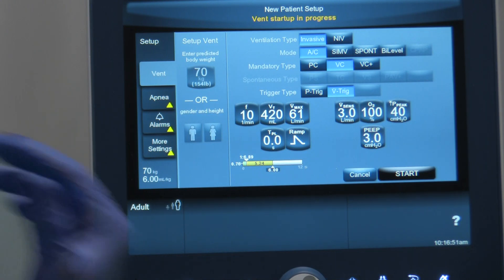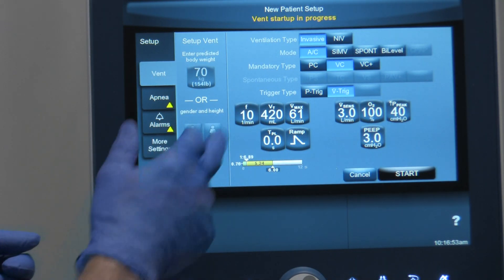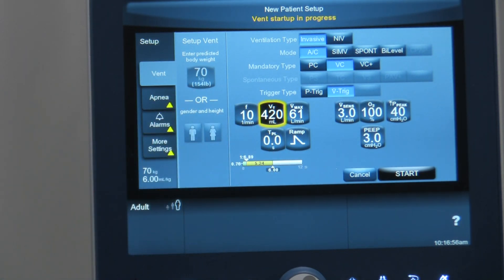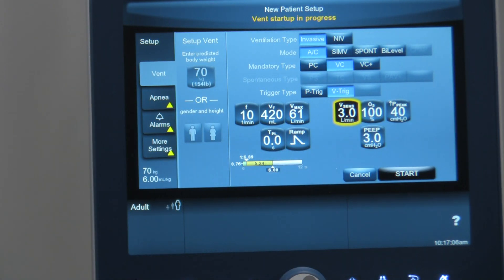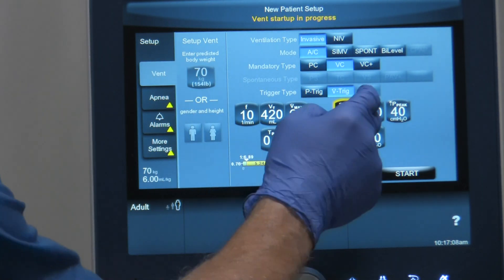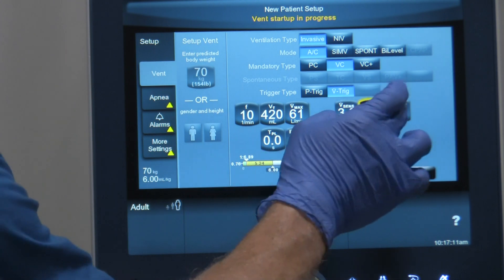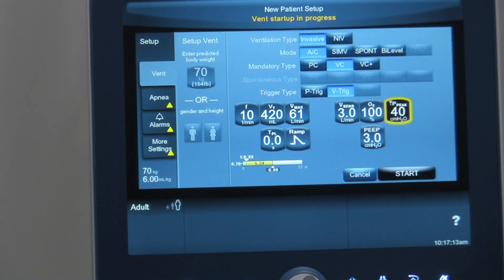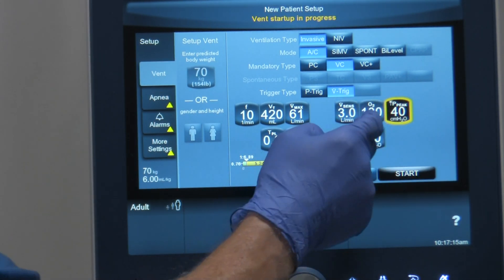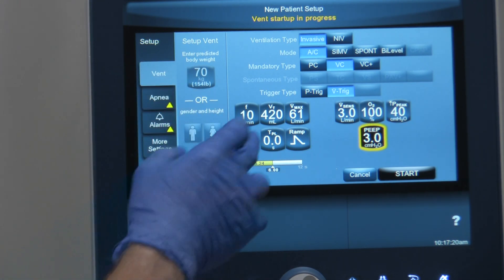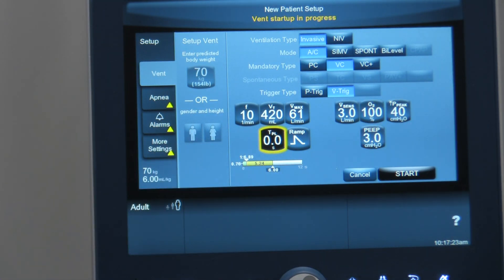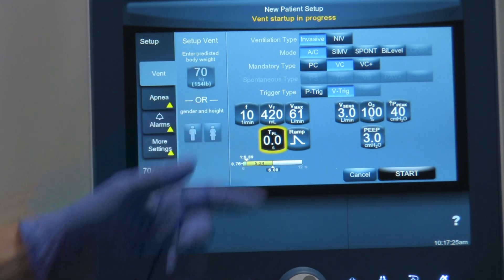The settings we can choose from include respiratory rate, tidal volume (since we're volume-ventilating), flow rate, and in setting the tidal volume and flow rate you get a TI time. It also lets you choose the sensitivity you want, the FiO2 delivery, your high pressure alarm, and your PEEP setting. At the bottom, if you want to incorporate an inspiratory hold or a plateau, you can choose to do that as well.